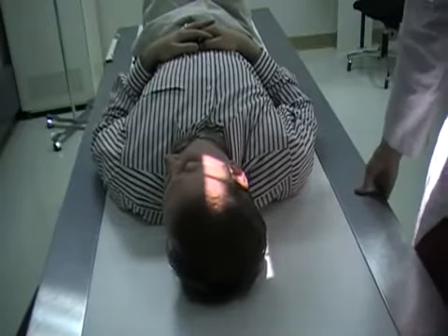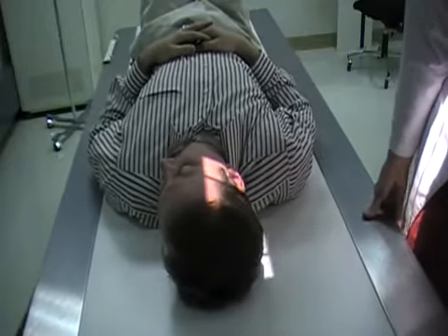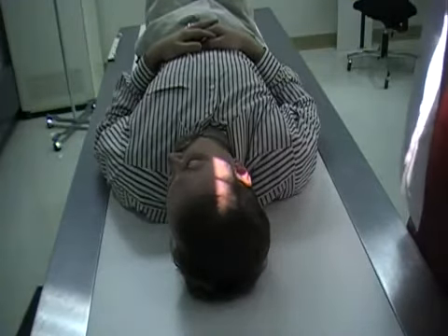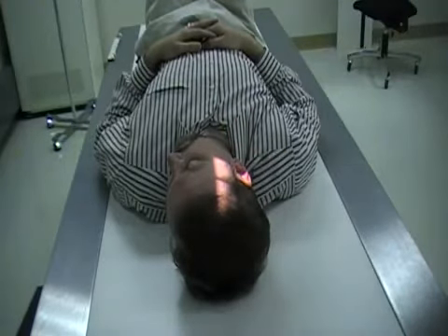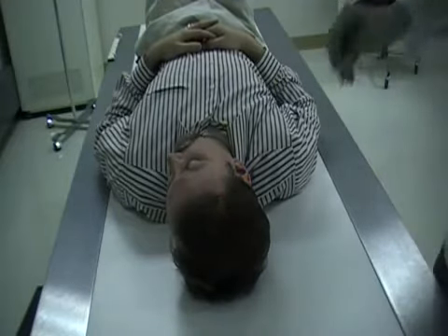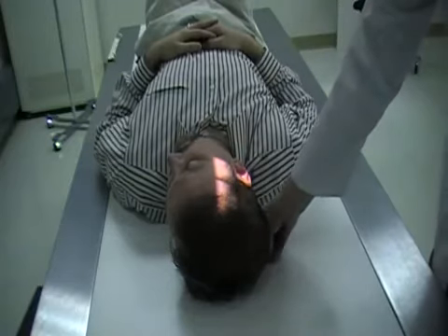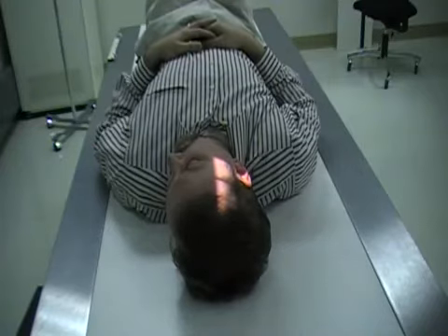With the Arcelin, come above the EAM about an inch. You do want to collimate tight for this as well. On the Arcelin, the side that you're going for is going to be farther from the image receptor. So we're going for that right side — you can place your marker on the corner edge of the light or you can place it down onto the table. This is the Arcelin method for the mastoid.